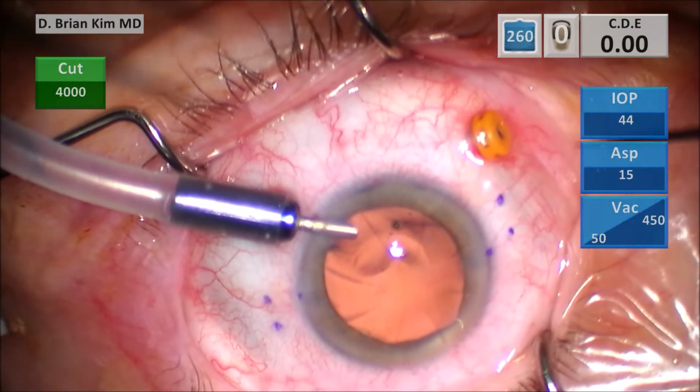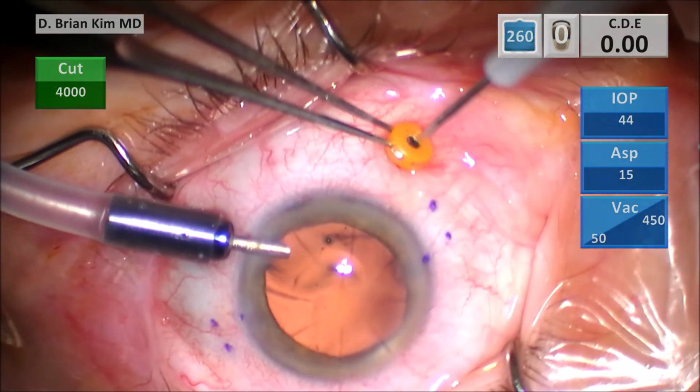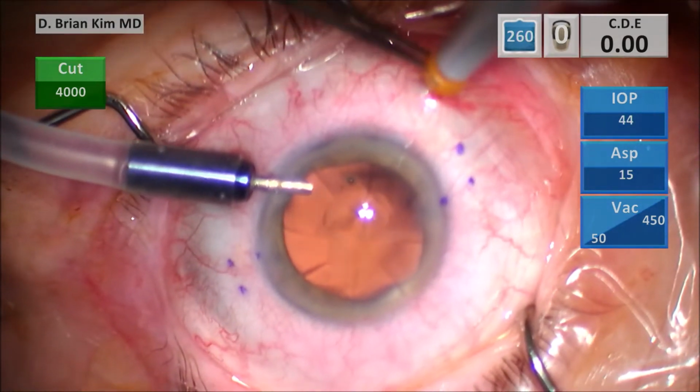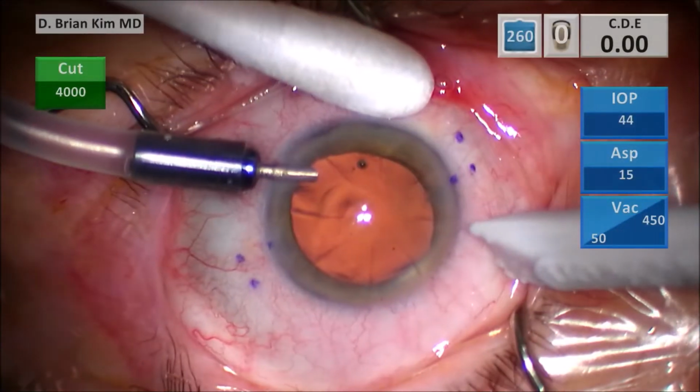But you can see here, this is a cool technique. This is the first time I've ever done this. I'm going to go ahead and put the needle back, pull the trocar out, and because it did a nice tunneled incision, that incision is going to self-seal. Turn on infusion. I've turned on infusion.